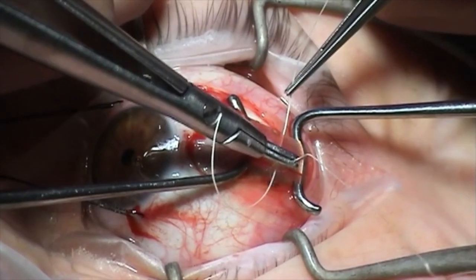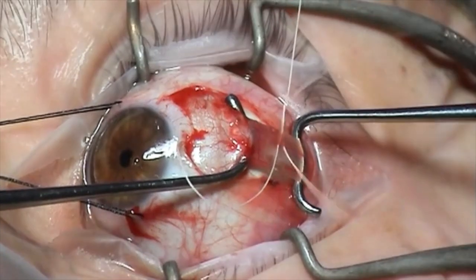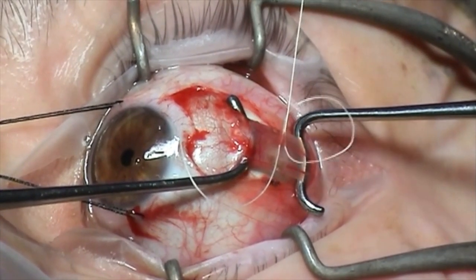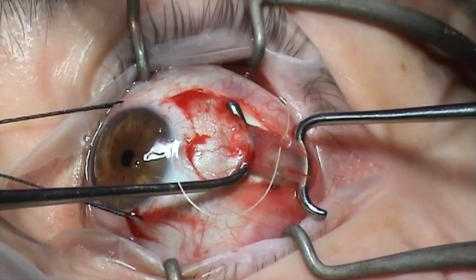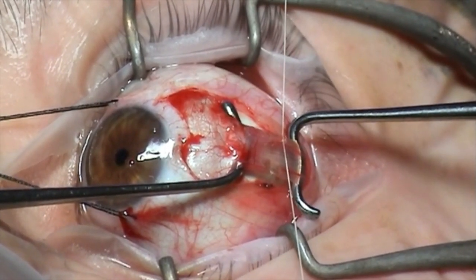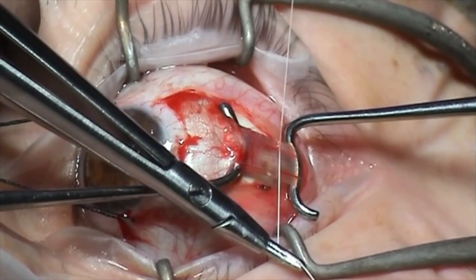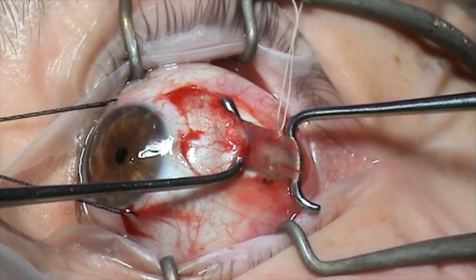Re-grasping the needle and then passing full thickness with the second pass. Note how the suture is slung around the body, not the tip of the needle, to make it easier to re-grasp the needle as it emerges from the muscle. Double throw and then single throws to secure the suture along this superior border.